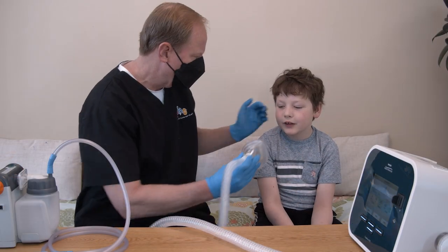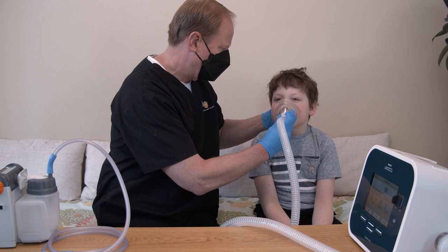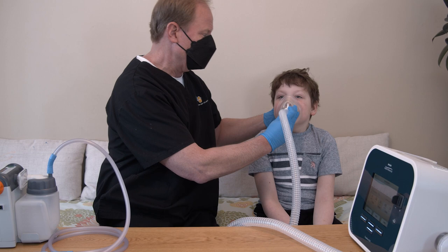Most children receive 3 to 5 cycles twice a day. Monitor your child's color, heart rate, and comfort level during the cycles.